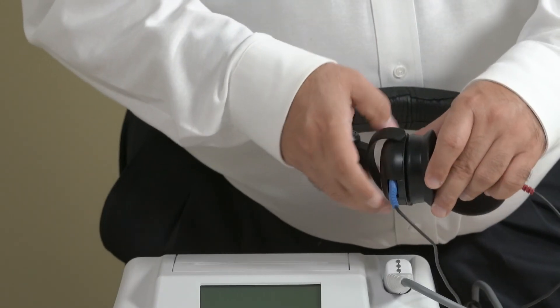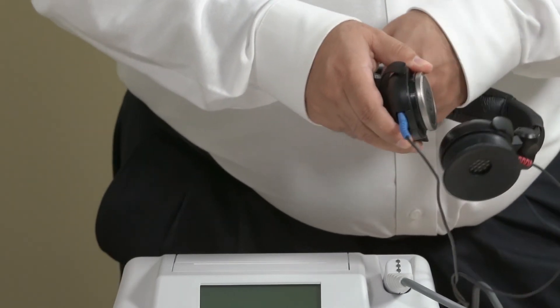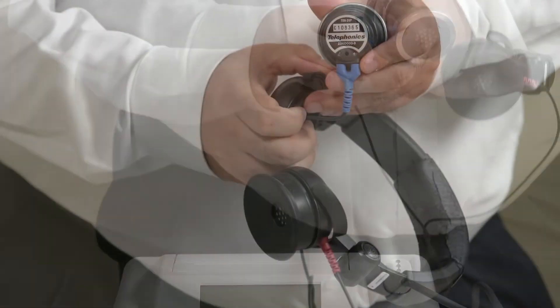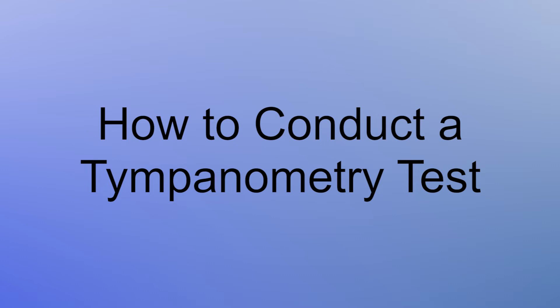If you experience an issue with sound in either side of the headphones, it is possible to determine the source of the problem by switching the red and blue Y cords. Now we'll show you how to conduct a tympanometry test.